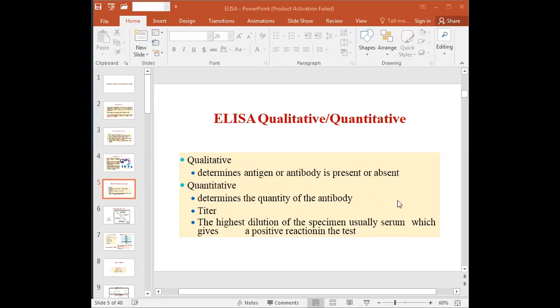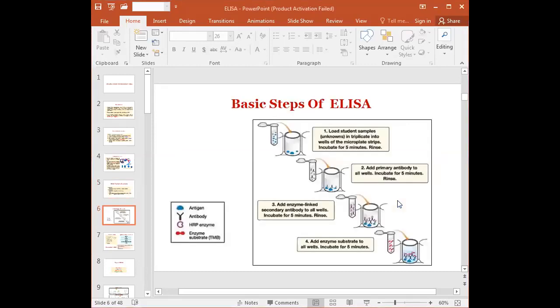By simply comparing with the data, with a table already provided to all of the laboratories, they can detect the load of sample or load of parasite present in the patient sample. To perform this process, we have to follow four different steps.